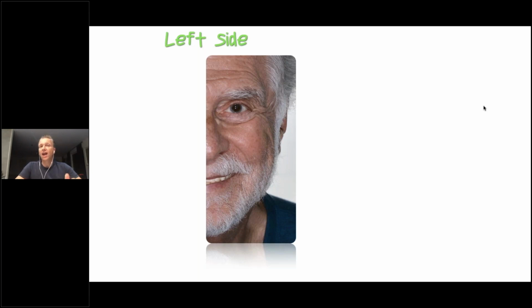We have a symmetric midline, which usually is taking the pupils and the middle of the pupils, and that can be totally off. If you look at me, I have a crooked nose. When I smile, I don't smile straight; I smile on this side more than on this side. So it's important to understand that these facial landmarks basically are different.